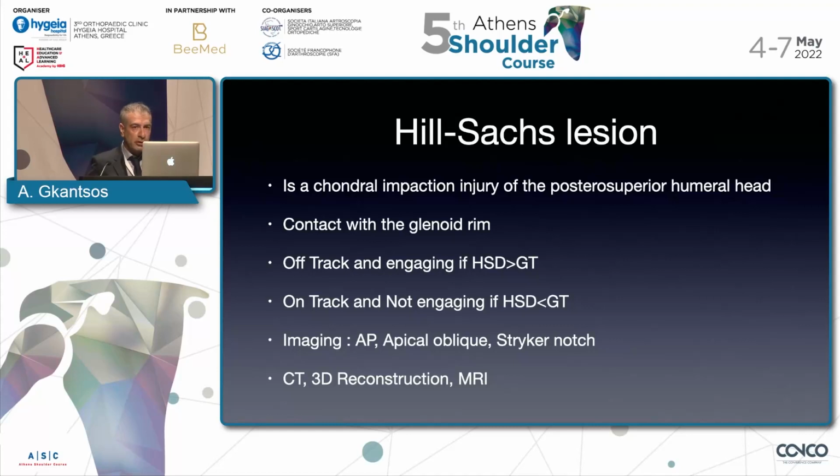The actual tools that we use are X-rays, the apical oblique, the Stryker notch view. The most accurate tool to measure this lesion is a 3D reconstruction CT, and the most accurate tool to diagnose this lesion is the MRI, of course.